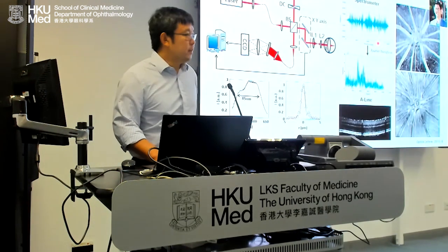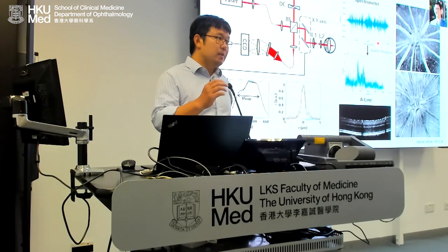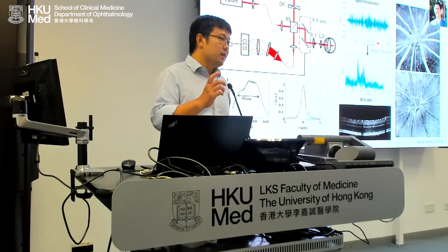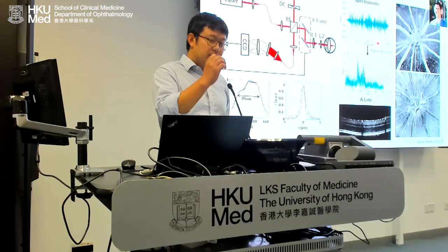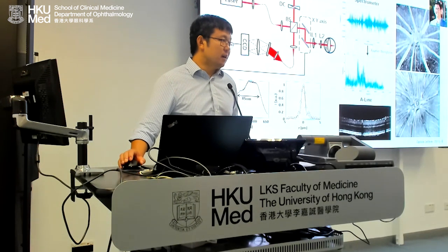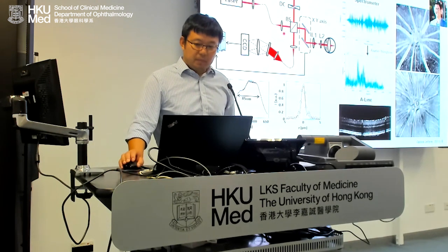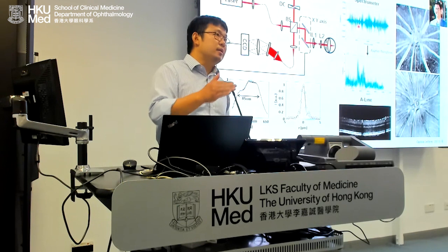This is the first paper published in 2013, as I mentioned. At the time, there were not even fiber optics components for this spectral range because nobody was using it. We could not even buy fiber optics, connectors, fiber couplers, anything. It just didn't exist. So we had to build a free space OCT. Everything is glass-based on the optical table. GE was the lead author on that paper. He just received tenure this year at Hopkins.